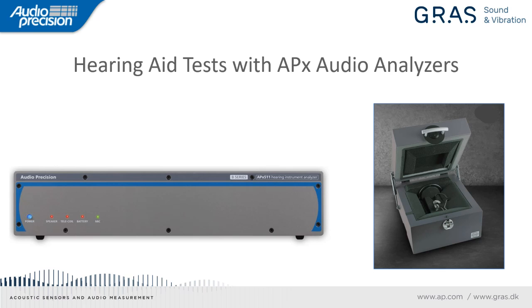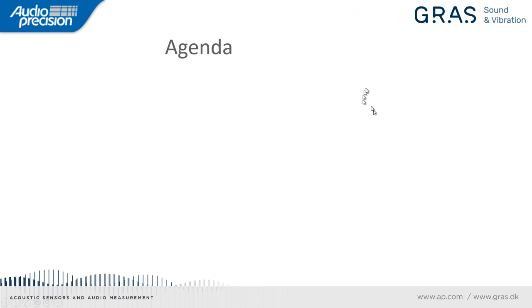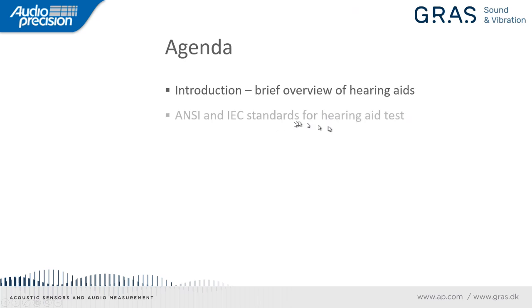All right, so let's get going with the webinar. The agenda for what we're going to cover today: a very brief introduction to hearing aids. As I say this, I want to point out that I have a lot of expertise in audio analyzers, especially Audio Precision ones, and in terms of hearing aids, I'm really not an expert. So for those of you that work in the industry, you might find this a little bit light on the hearing aid side of things, but hopefully you can learn something about our offerings in audio test.